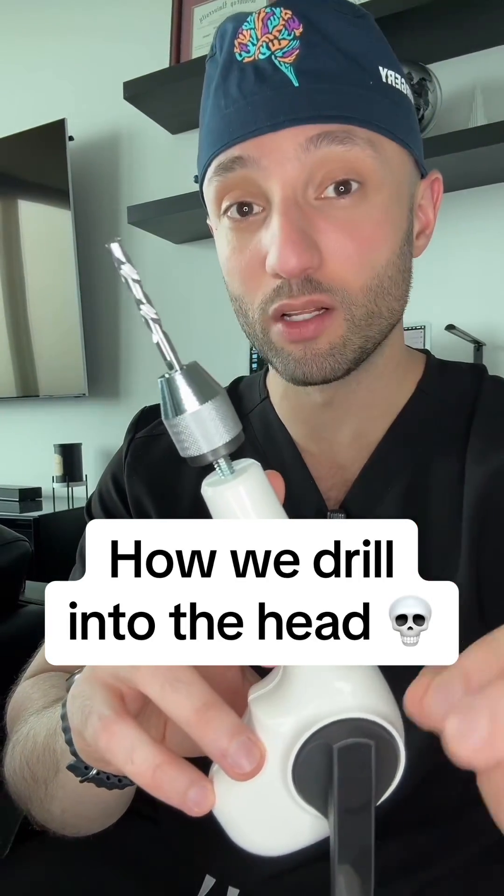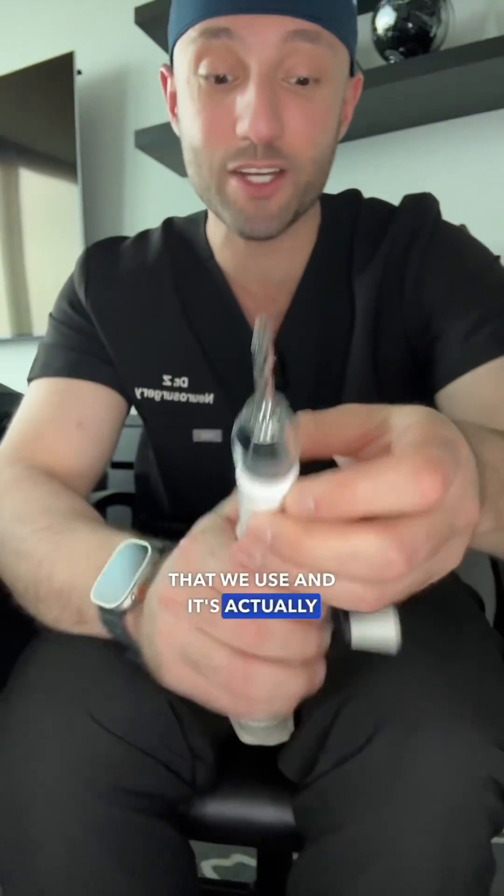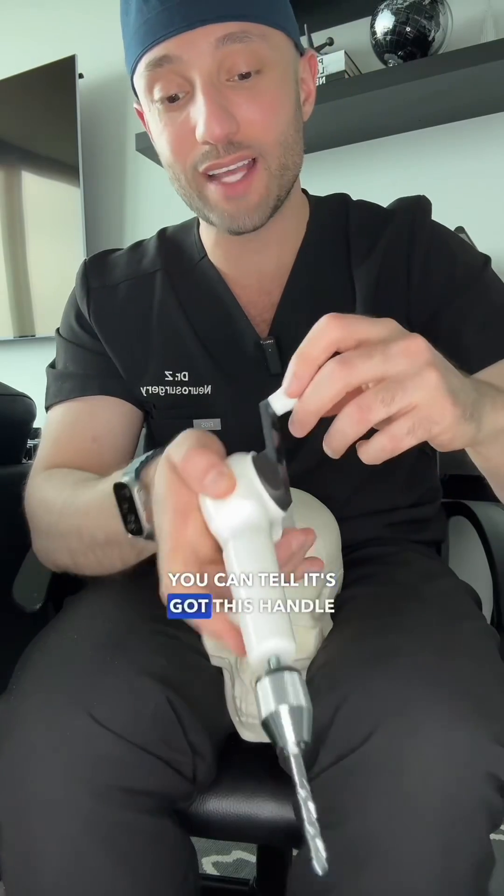This is what we use to drill into your skull. This is the drill bit that we use and it's actually a manual drill. You can tell it's got this handle here and when we turn it, it makes the drill bit spin. Here's how we do it.